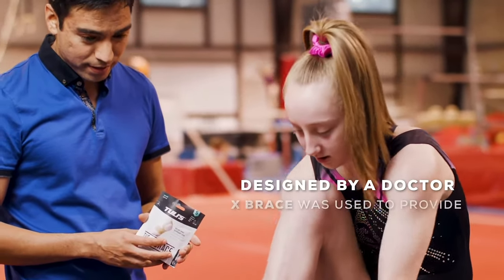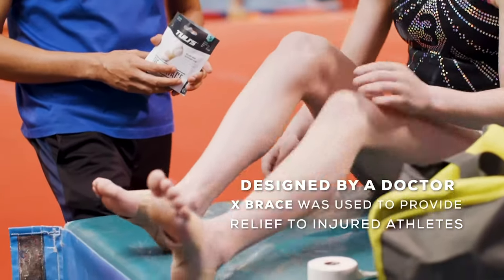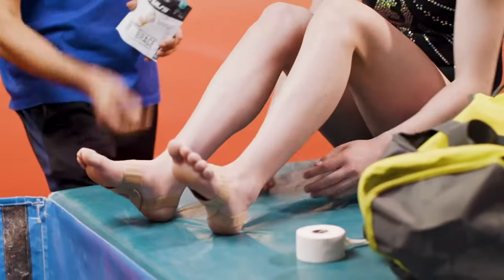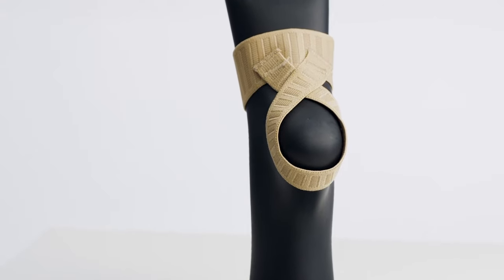Designed by a doctor, the X-Brace was first used to provide relief to injured athletes, but it isn't just for athletes. Individuals from all walks of life have benefited from this simple, yet efficient brace.